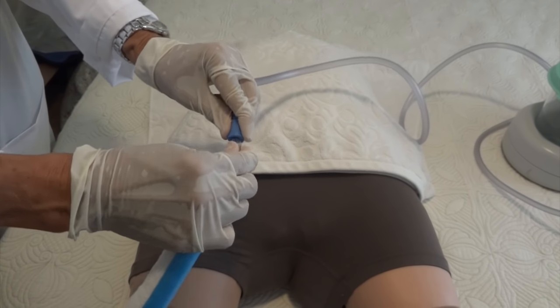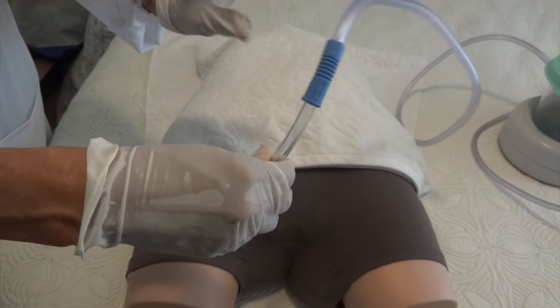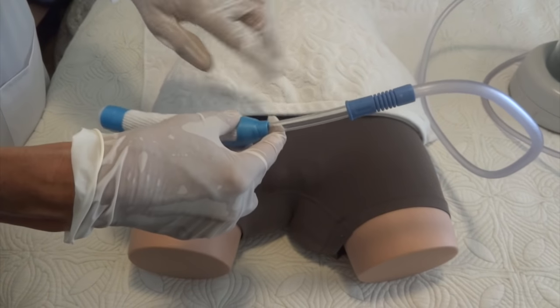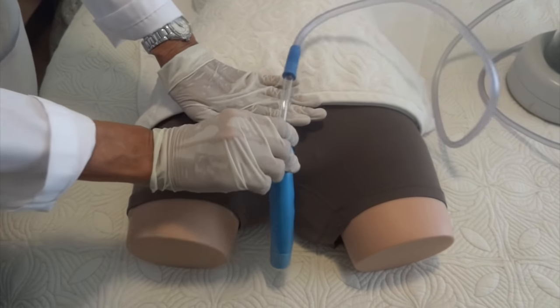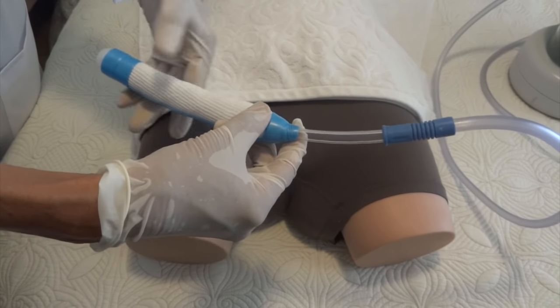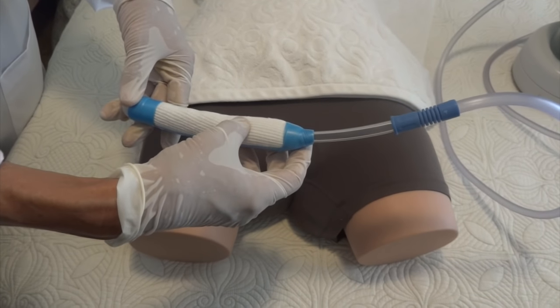Connect the wick to the tubing. When you're placing the wick, you want to have your thumb at the level of the top part of the wick, and then the thumb goes to the level of the pubic bone. You want the urethra to be around the top third of the wick.